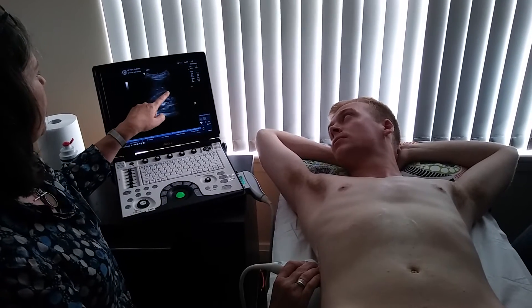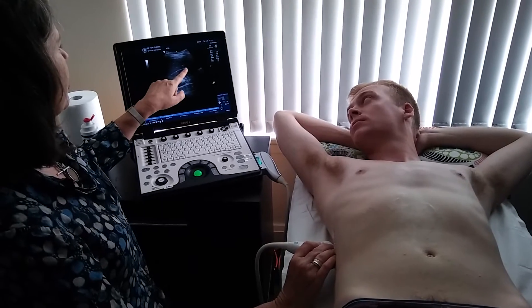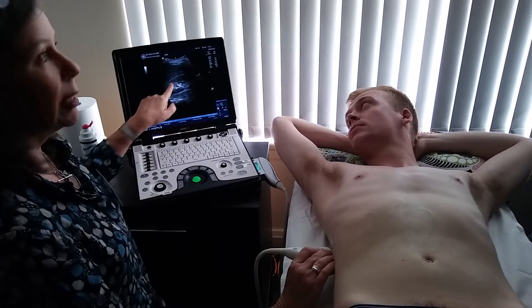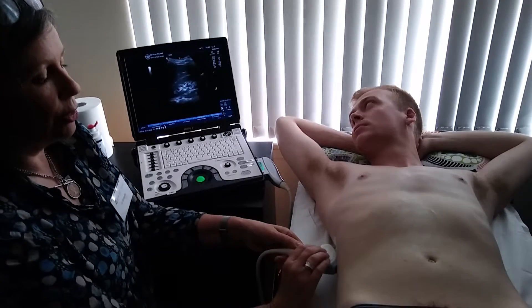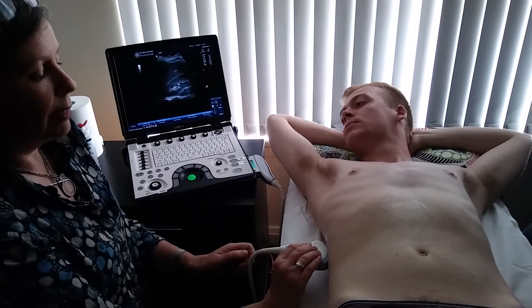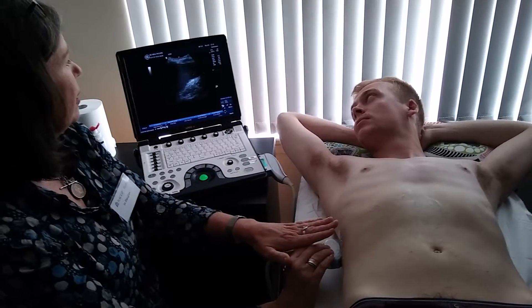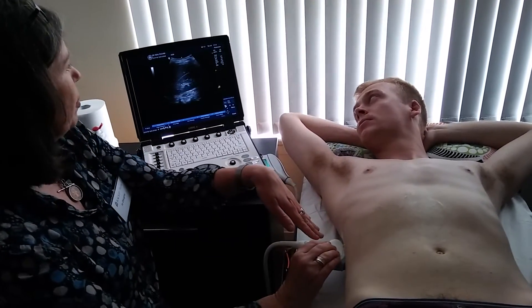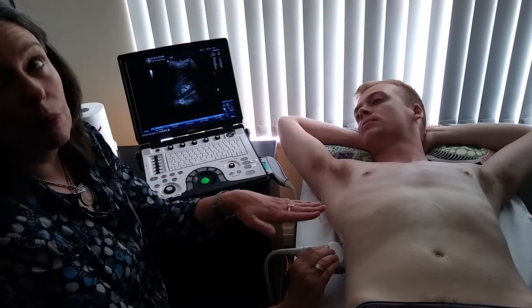This is the potential Morrison's pouch where the kidney abuts the liver. So this is where we get the blood. Now that I'm there, all I'm going to do is what we call fanning. I'm going to tilt the probe towards Jake's tummy - I've gone out of the kidney. I'm going to tilt the probe down towards the table - I've gone out the other side. So what I've done is fanned through Morrison's pouch.